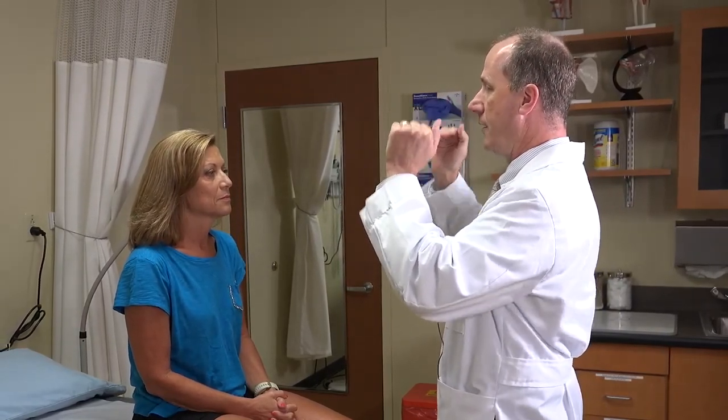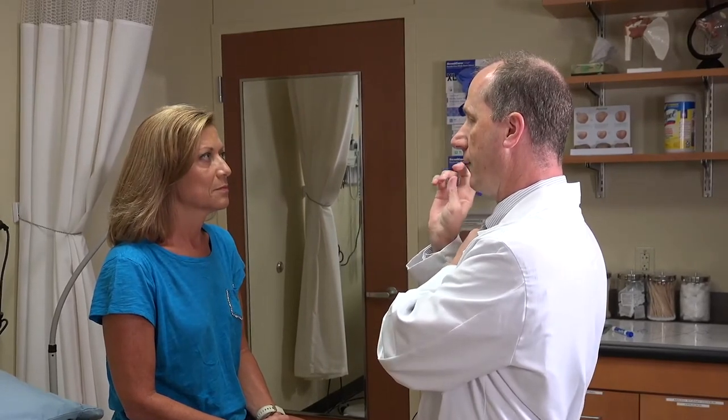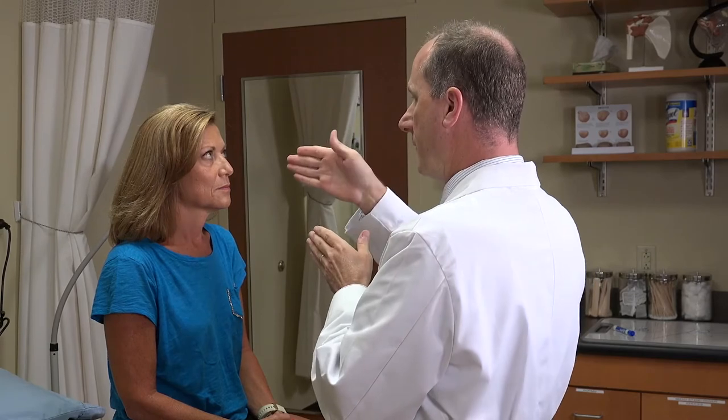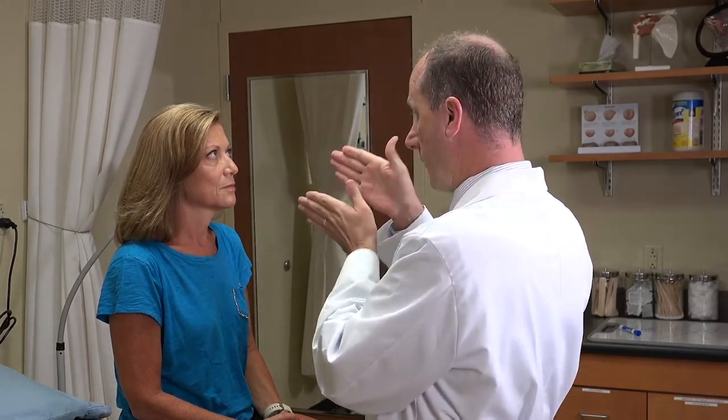One of the things you've probably seen in other videos on looking in the back of the eye is that you start somewhere very lateral, find a vessel, and follow it back to the optic disc. What I'm going to teach you is how to effectively land right on the optic disc the very first time. It's very much about positioning. You want to sink down so you're facing the patient eye to eye. Then have the patient look over your shoulder and slightly up at a point on the wall. Then you move over about 20 degrees, and from this position you know anatomically you're going to land very close to the optic disc because it's a little bit medial and a little bit down.